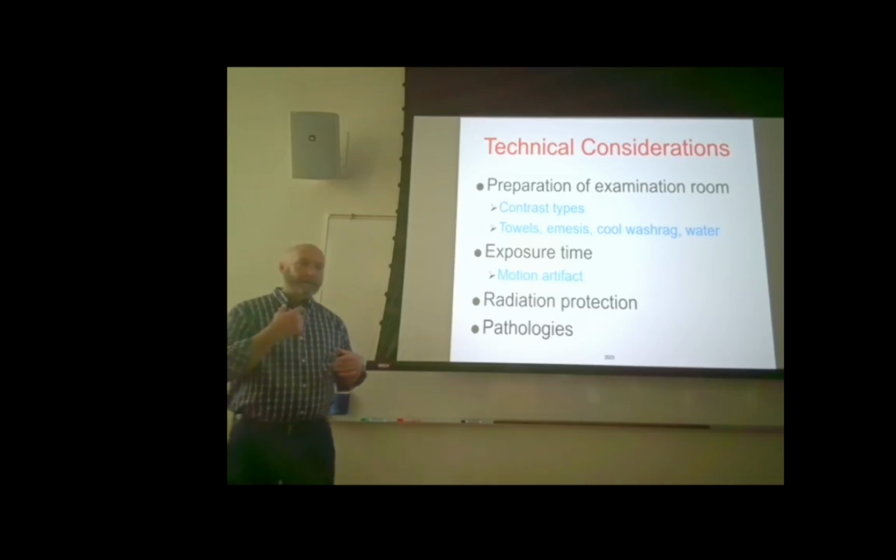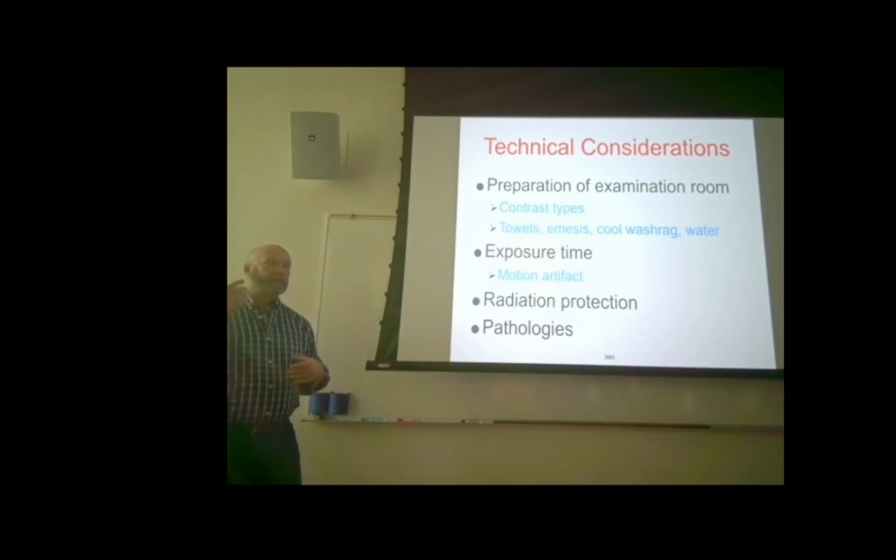And you want the esophagus as full as possible. You want thick barium. If you're doing an esophagram with an upper GI, it's going to take a while for the contrast to get out of the stomach. You still want thick barium.